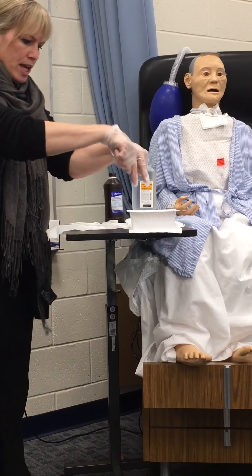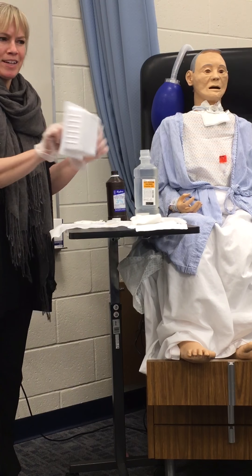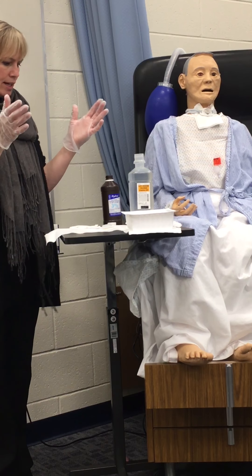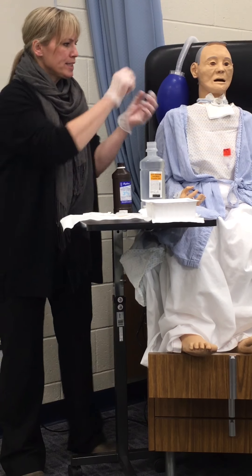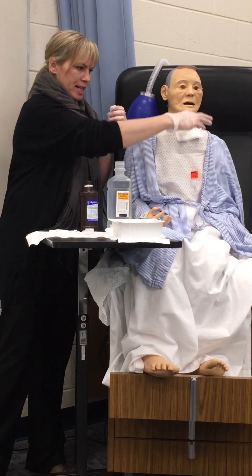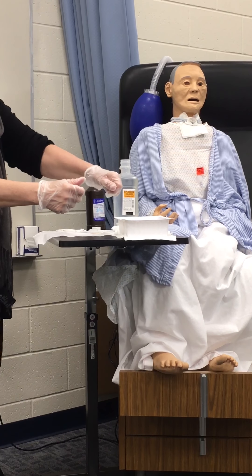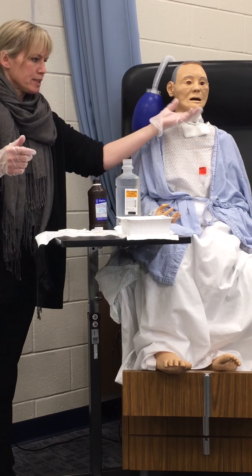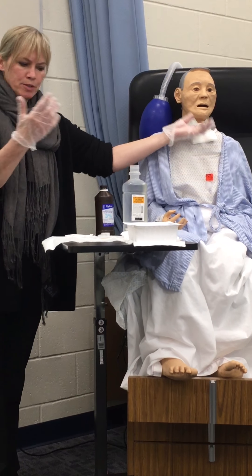This is your main tool for scrubbing and cleaning. These are often used for drying, and so is this. Some patients will cough with just the tiniest little bit of fluid in there. This is that old-fashioned shoelace that we used to tie — don't ever use that. If it's something you don't use, just drop it. Now this is my kit, but I cannot put this here because the bottom's not sterile — that's why I put it there, inside. Now I'd have to designate non-sterile and sterile. You have to decide what you're better at — I'm better at opening this and pinching that. I'm stronger with my right hand holding, and this hand can scrub.